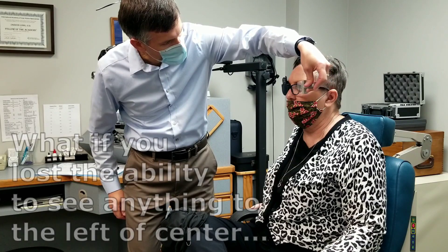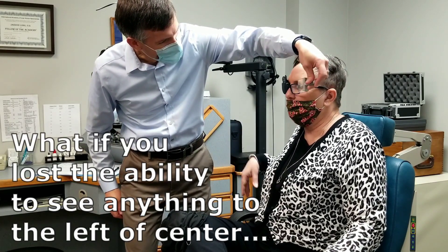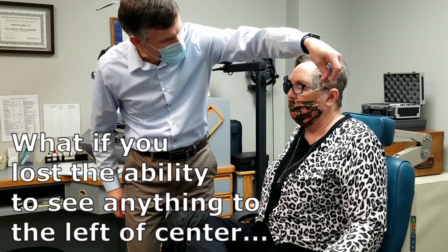The lens is off to the side, so it may surprise you. It may not. Wow. I see it. I see it. Oh my gosh. I do. What do you think about that?